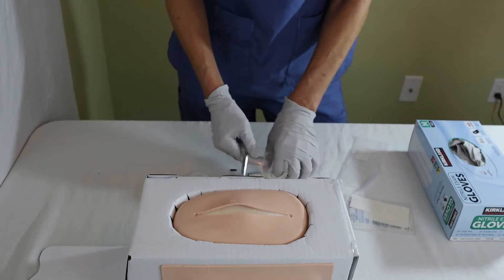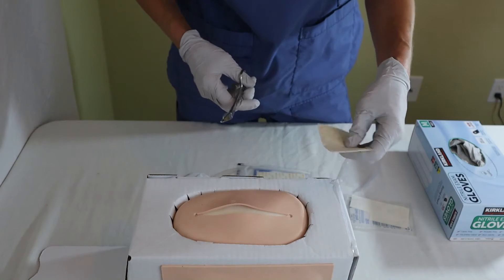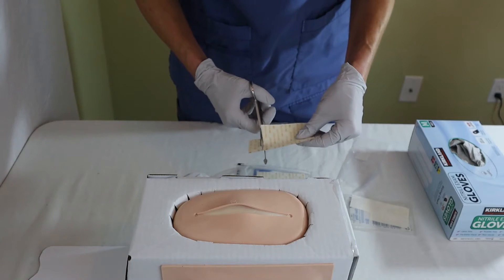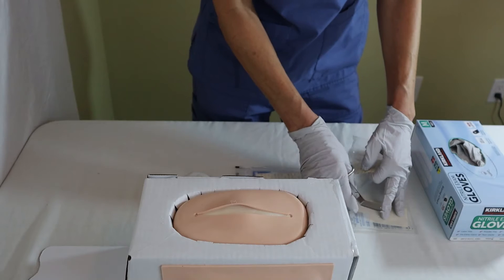I'm going to prepare my strips. I'll take out one of these strips — this is a little bit too long — so I'll take my scissors and cut off the end to make it the correct length for this particular patient.